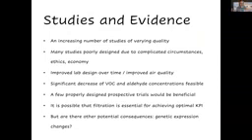In other words, a lab has been used with clear outcomes, and then that lab is left behind, and a new lab is established according to standards such as those I have described here. Improved air quality is achieved, and it is shown that there is improved air quality, and that may or may not show itself in improvements in IVF outcomes. A significant decrease of VOC and aldehyde concentration is feasible when you do all this.